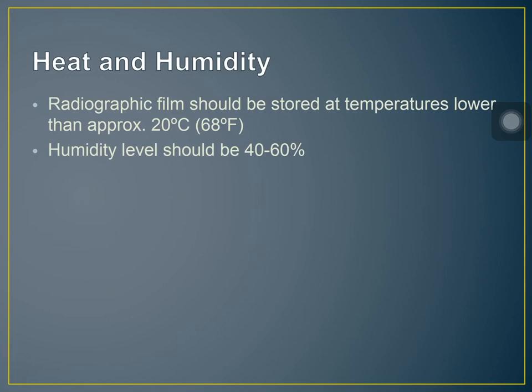So, once our humidity level increased by greater than 60%, we will have an increased fog on the radiograph, on the film. Once our humidity level dips to below 40%, what would happen on the radiograph? Magkaka-fog pa po ba? Magkakaroon ng static artifacts.